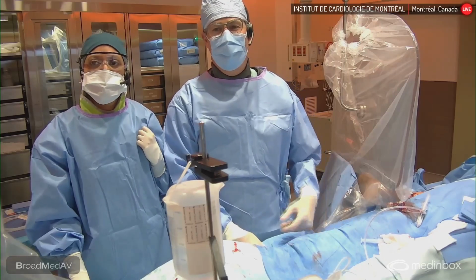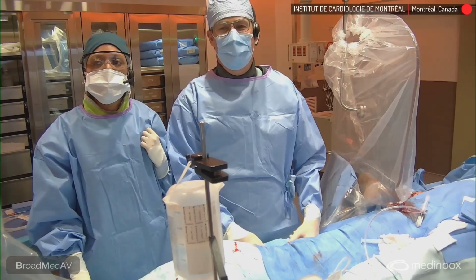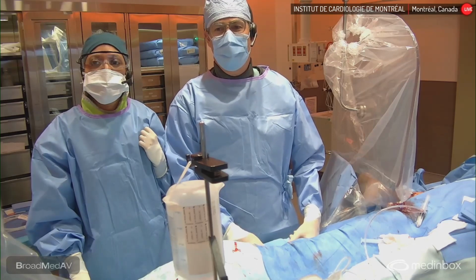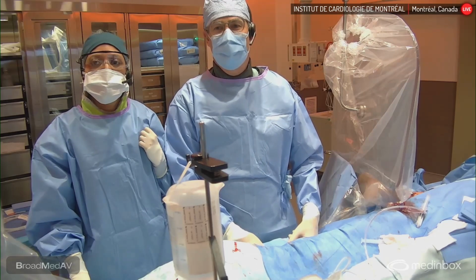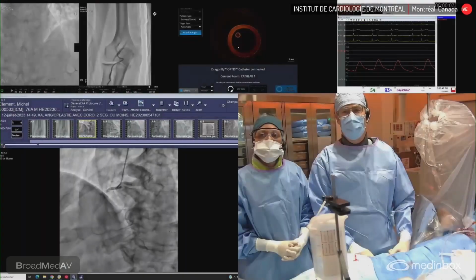I'm here today to discuss a case entitled the Multivessel Disease PCI in the context of STEMI. It is a pragmatic approach that we have here at the Montreal Heart Institute. It's not necessarily institutional, but we do it fairly similarly all together as a group.